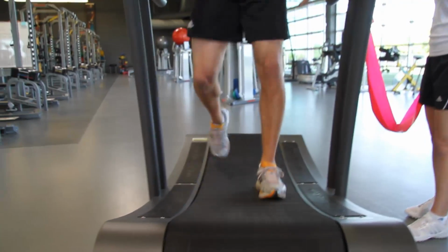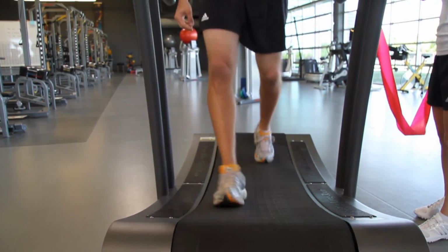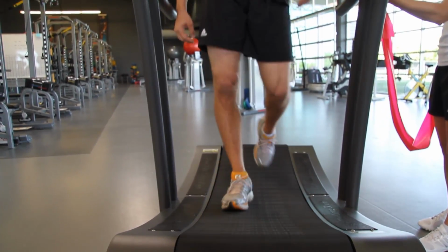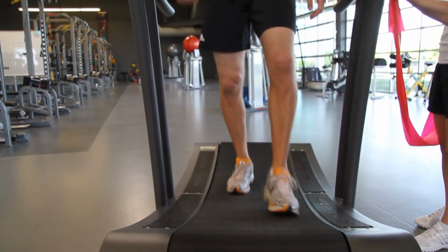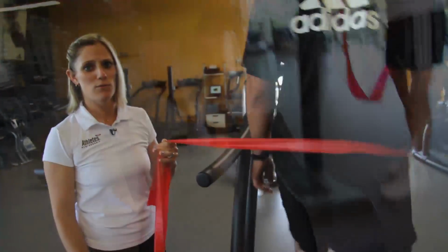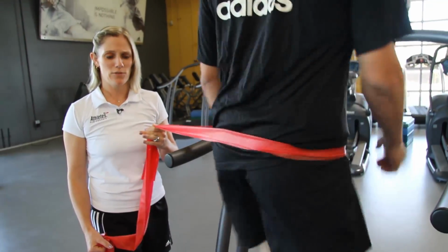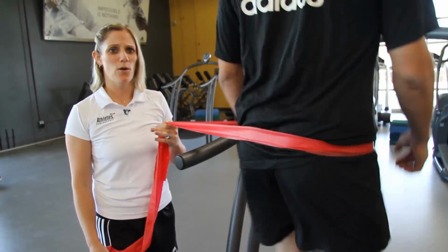As we do this, we should see his mechanics normalize, and he should start getting improved lateral translation of that pelvis over his femur on the right side. I'm doing that by encouraging his dysfunction, pulling him towards me so that he must resist the band and counter by pushing his hips away from me.